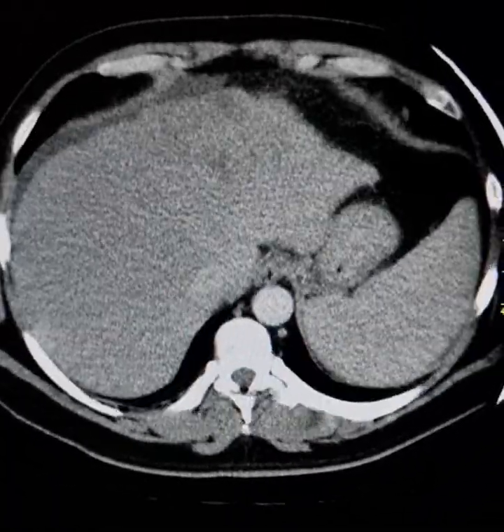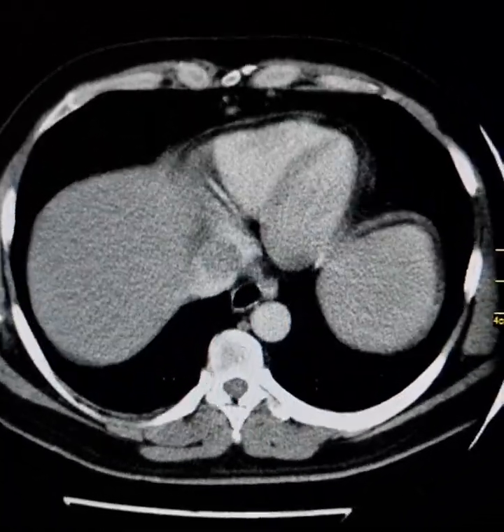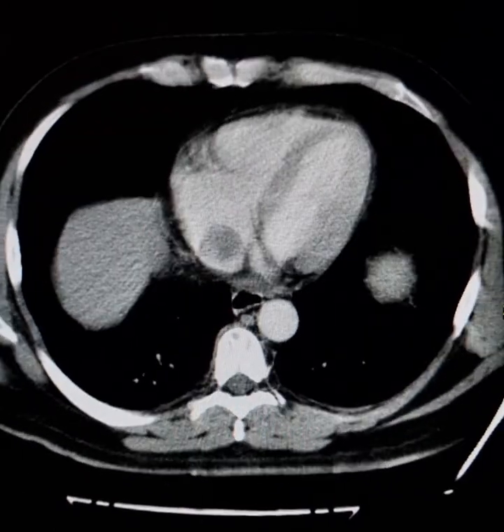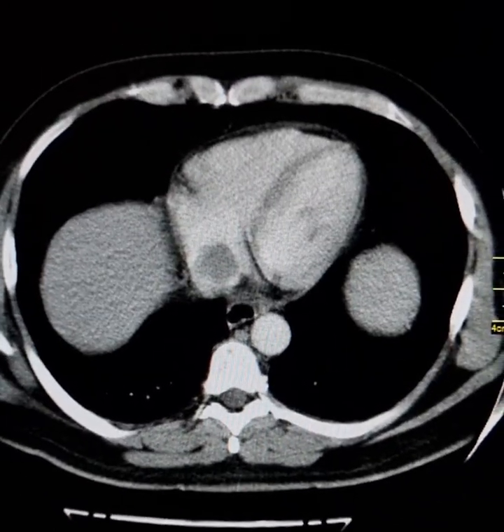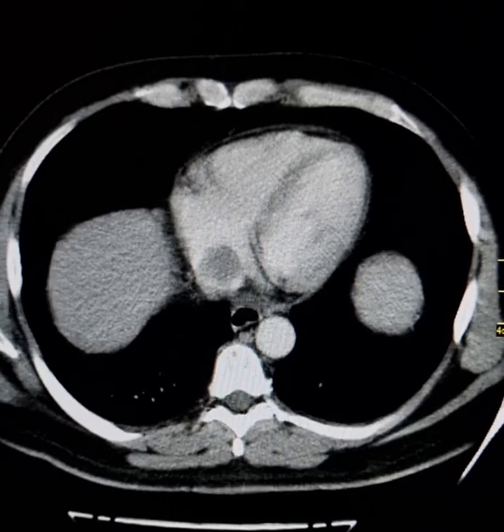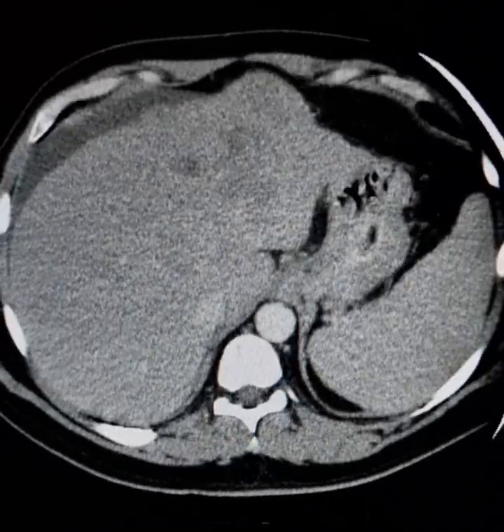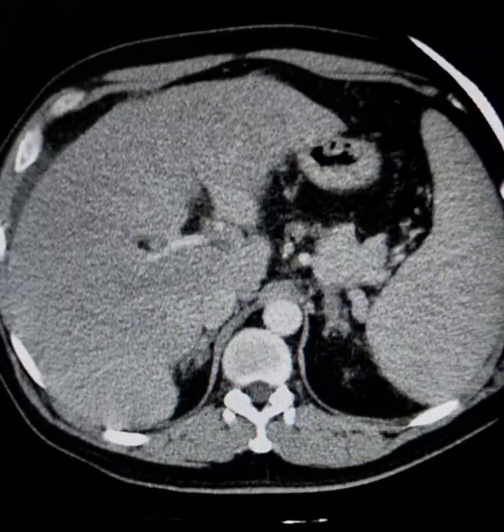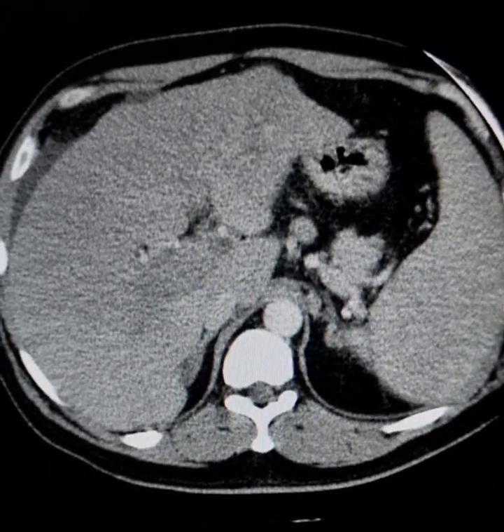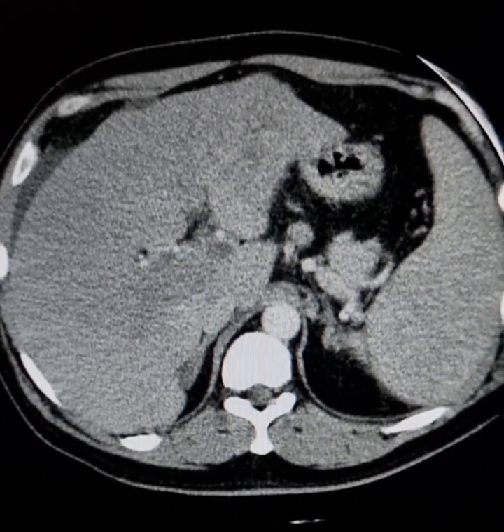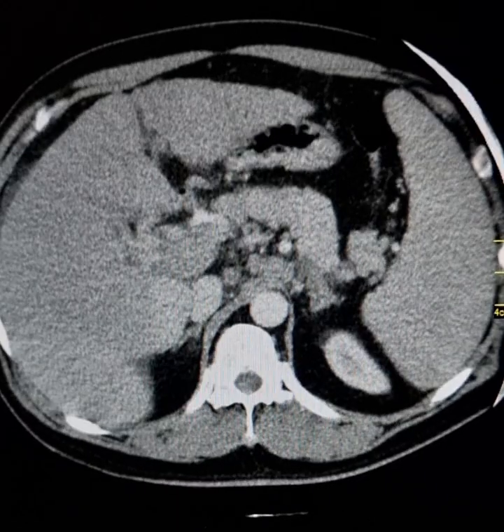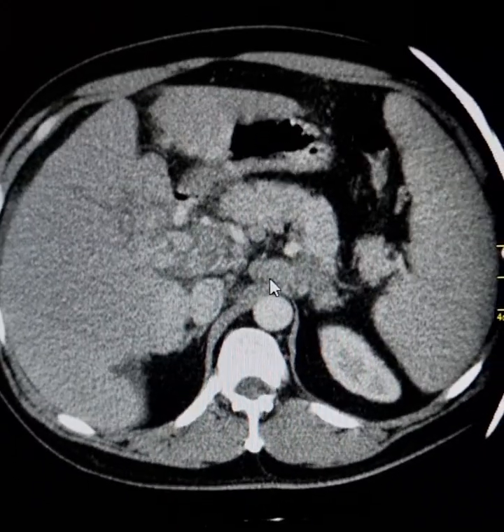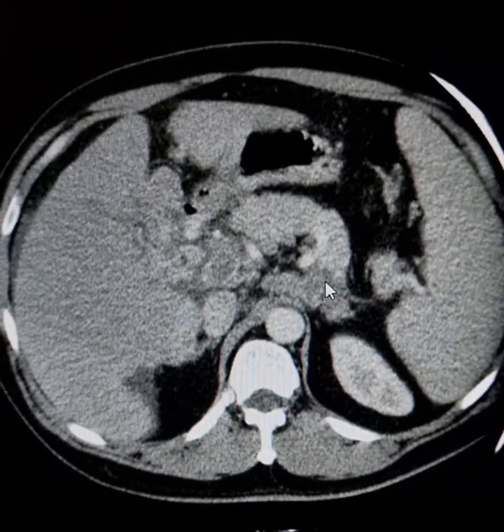Note that the tumor thrombus has grown into the left hepatic vein, the inferior vena cava, and ultimately into the right heart. There is ascites here. There are also metastatic lymph nodes present.